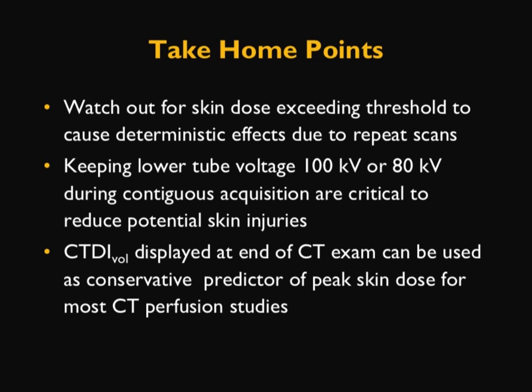Therefore, by optimizing the protocol, keeping the tube voltage low, and watching the number of acquisitions during CT perfusion studies, it is possible, and it is done in a very safe manner, since CT perfusion is showing very beneficial application for evaluating stroke patients and other studies.